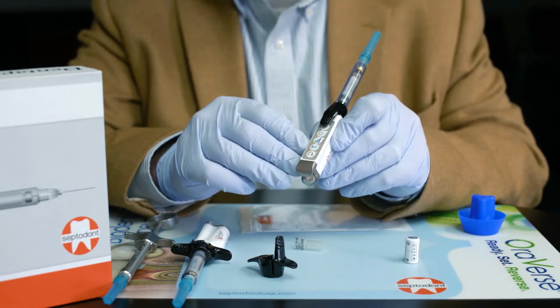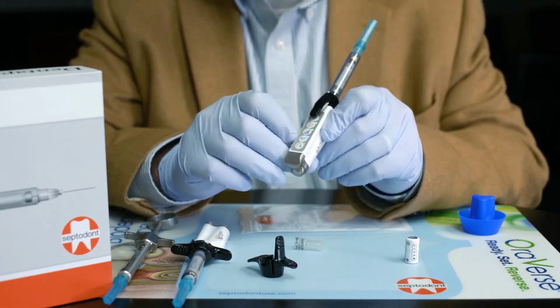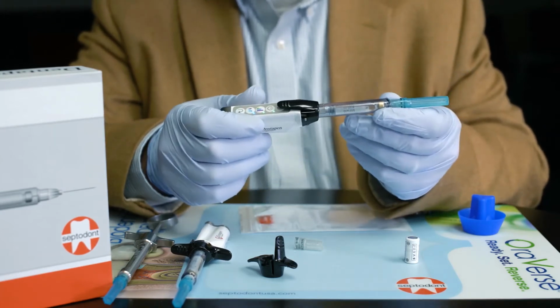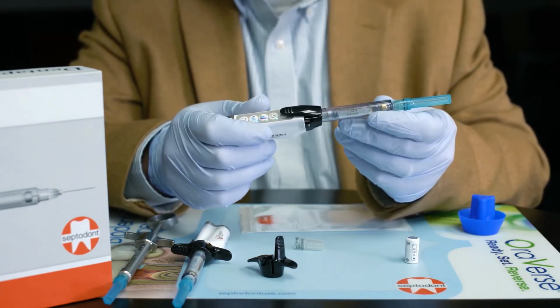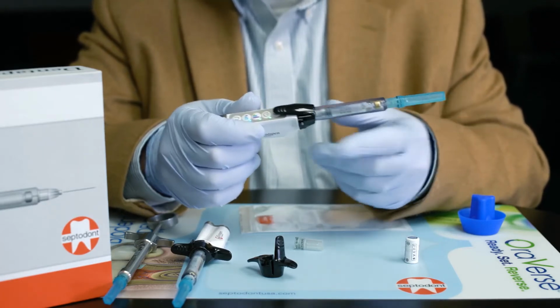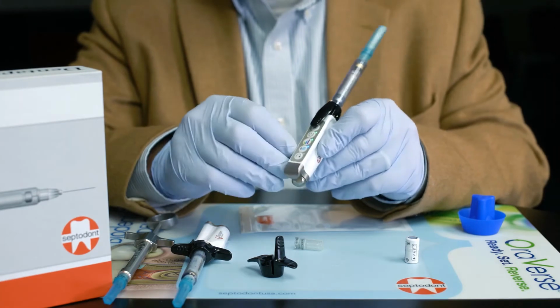Next button is the mode button. There are 2 modes. The blue is the ramp-up mode. With the ramp-up mode, it's going to deliver very small amounts of anesthetic and ramp up to the speed you selected. And that's good to numb the tissue in advance of the needle as you insert it into the tissue.